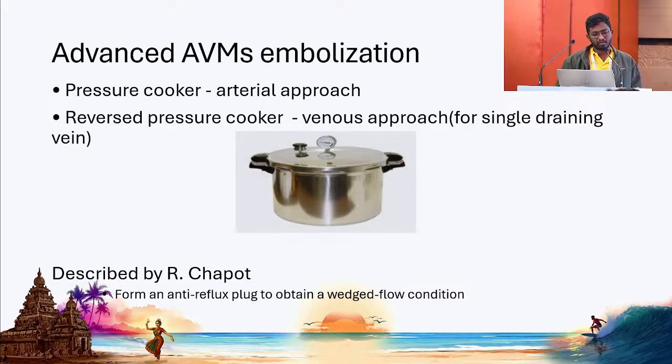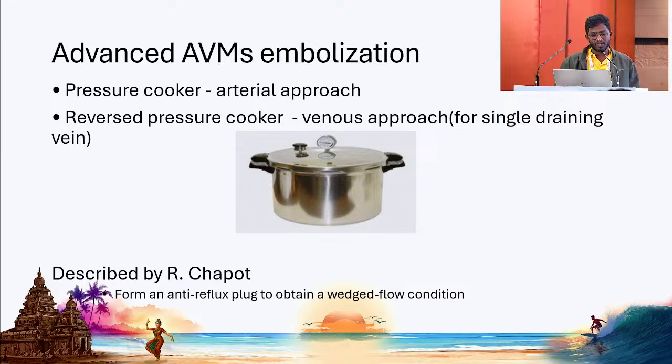We have not tried this pressure cooker technique. In most of the cases, the microcatheter got well wedged into the feeding artery, and we did not form that much reflux, so we formed the proximal plug with the Onyx. We didn't use these advanced techniques.